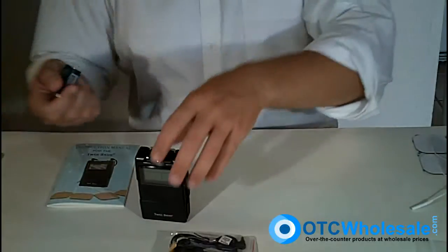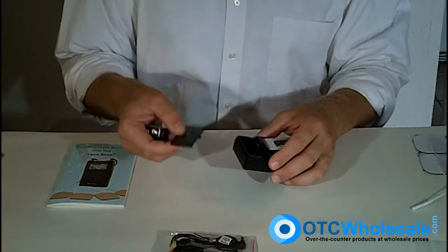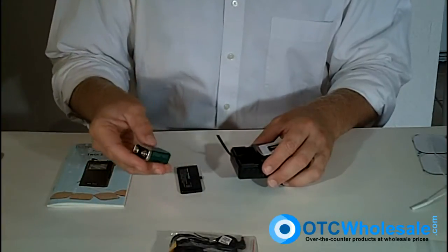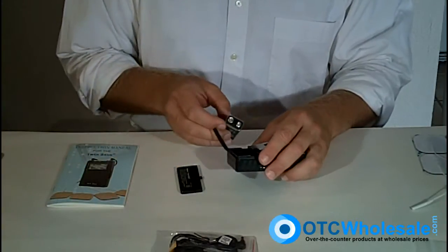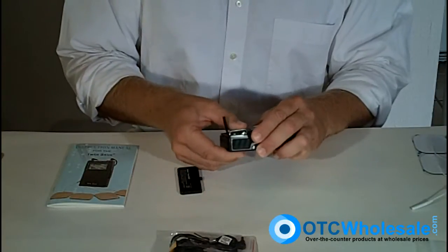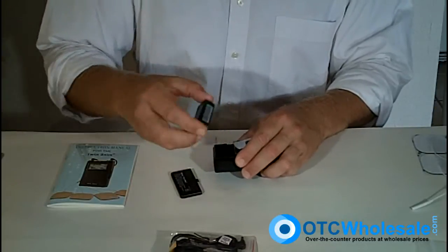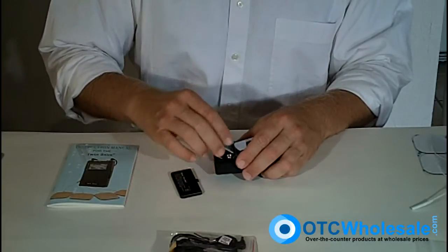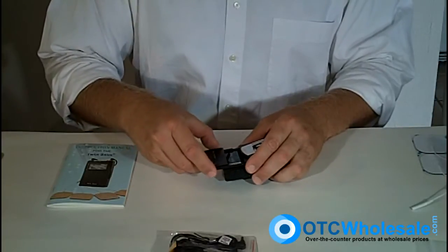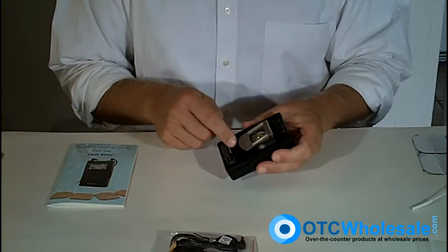To put the battery into the unit, just turn the unit on its back. It's got a very nice solid feel. Place the battery right in the back of the unit — it'll only let you put it in the correct way. Then put the battery door back on.